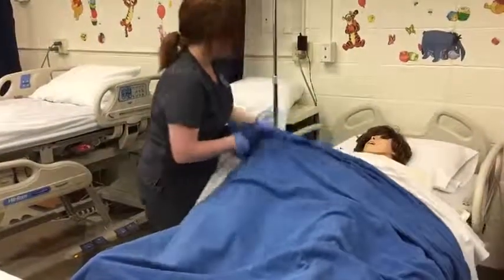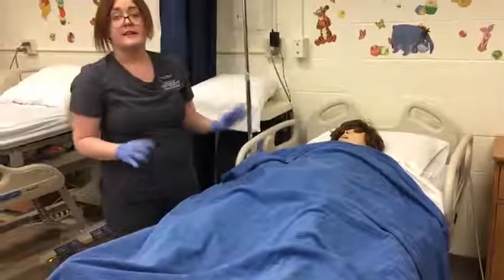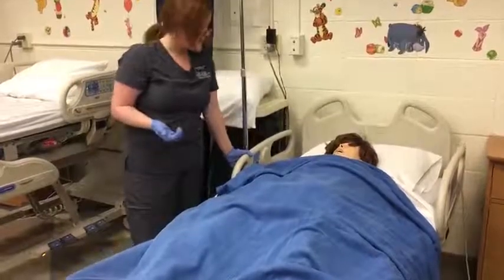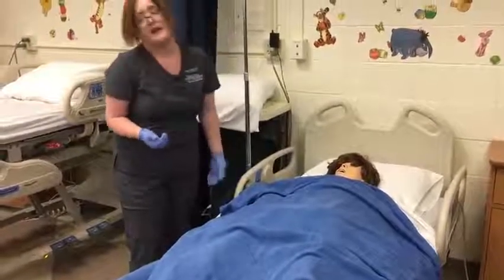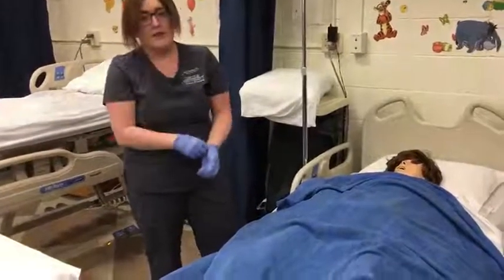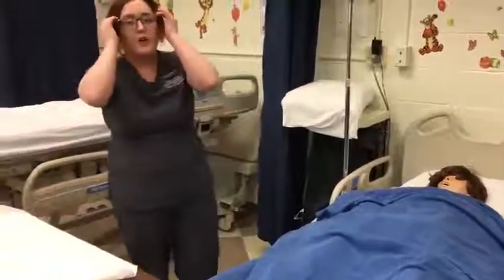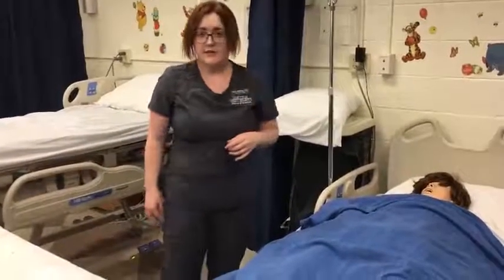Get her all covered back up again. I'm going to make sure that she doesn't need any more help or assistance before I leave the room. I'm going to put her bed into a low position for safety, make sure her call light is within reach and the bed is locked. And then I'm going to document the size of the catheter that I inserted, the initial void, including the color, odor, and amount, and how the patient tolerated the procedure.